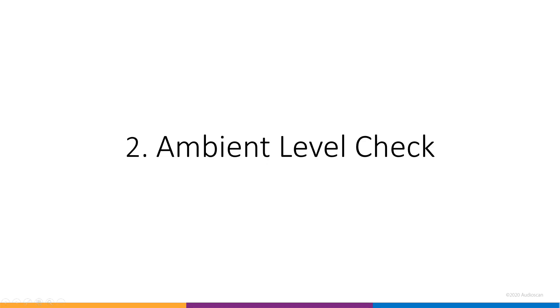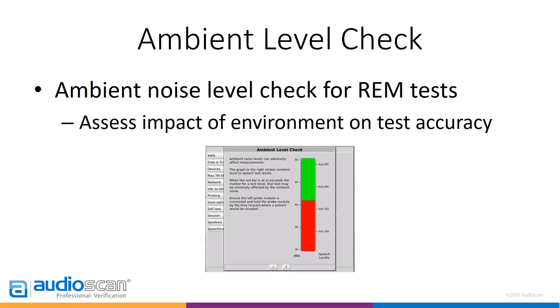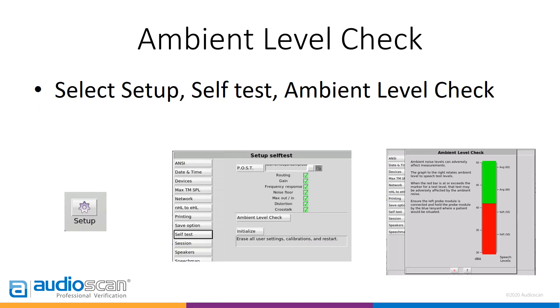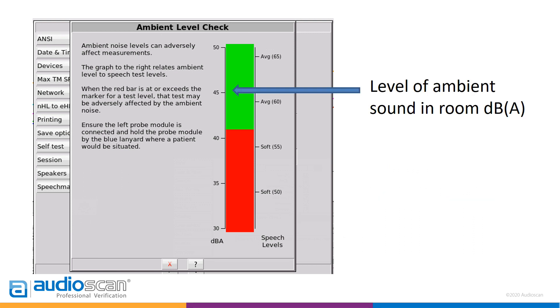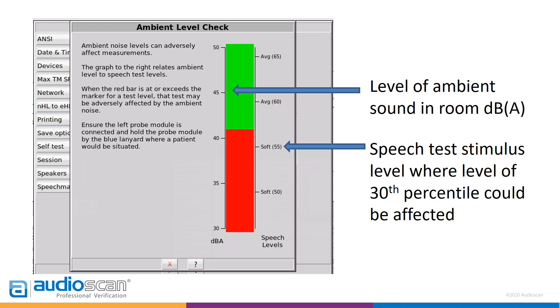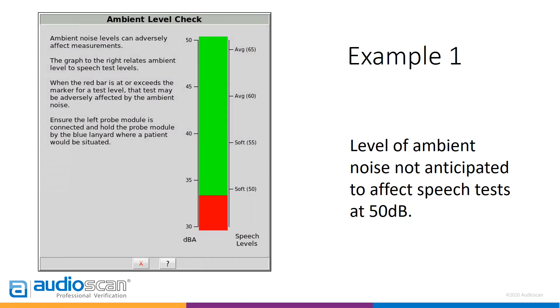Ambient Level Check. This feature is a test which measures the ambient noise level in the test environment to allow you to determine its possible impact on SpeechMap testing, particularly at soft input levels. To access the tool, open the Setup menu, select Self-Test, then click on Ambient Level Check. The red portion of the bar graph display represents the noise level in the room. The scale on the left shows the value in dB, A-weighted. The scale on the right shows the speech test level which could be affected by this noise level, based on the lowest levels of the speech stimulus, or the 30th percentile. In this example, the noise level is showing below the soft 50 marking, indicating that it's unlikely to impact testing at this level.